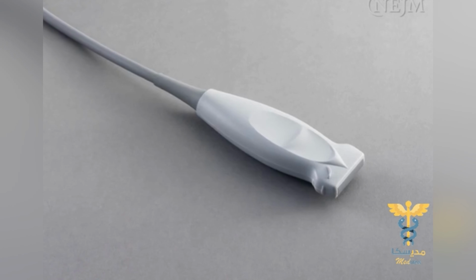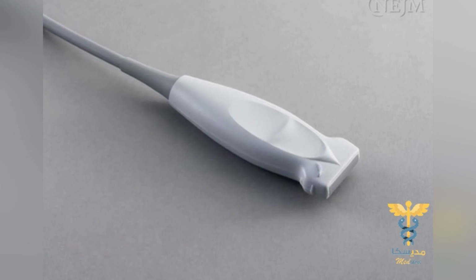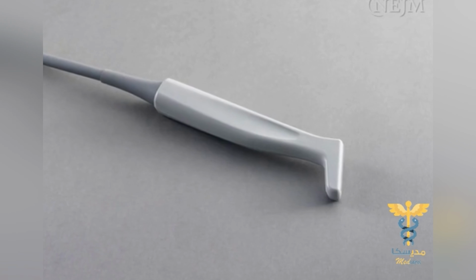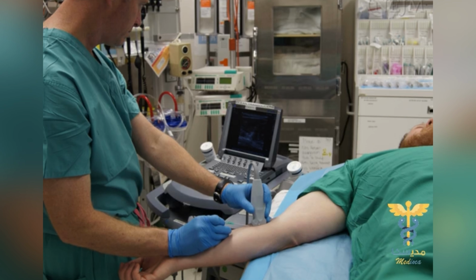A linear array transducer with a frequency of 5 to 13 MHz is usually used for ultrasound-guided vascular access. Short linear transducers are made specifically for ultrasound-guided procedures. It's best to place the arm in a horizontal position so the ultrasound images and needle movements are in the vertical plane. Elevate the bed or sit down so that you are not bending or stooping, but working with your hands comfortably in front of you.